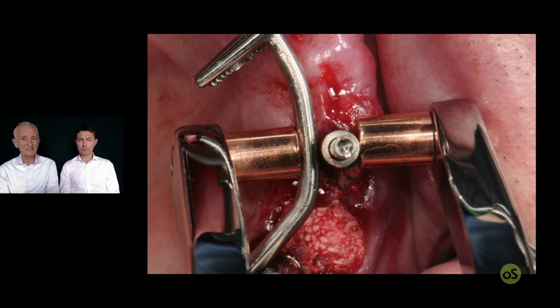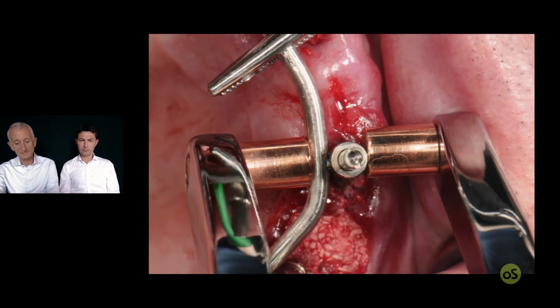Okay, so these steps are fundamental and important. Now let's say everything is fine, the clamp is released, the two pieces are in contact. You ask your assistants to activate the welding machine. You press your foot pedal and you do the welding.